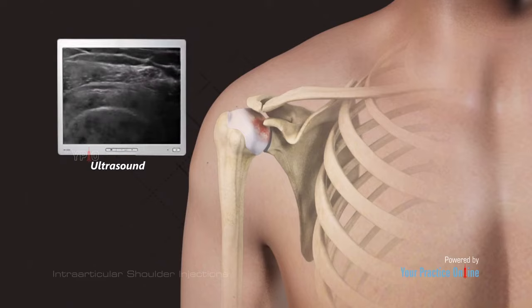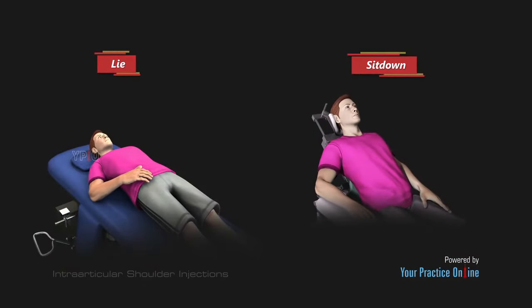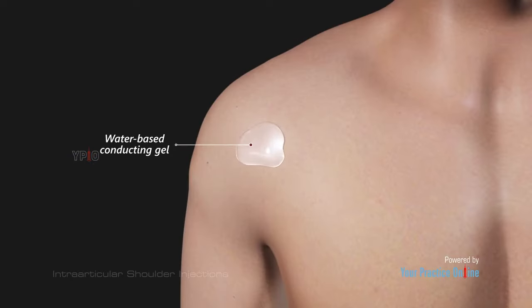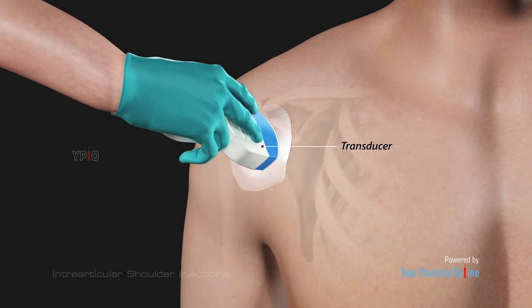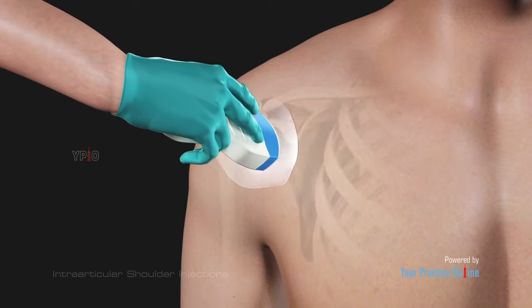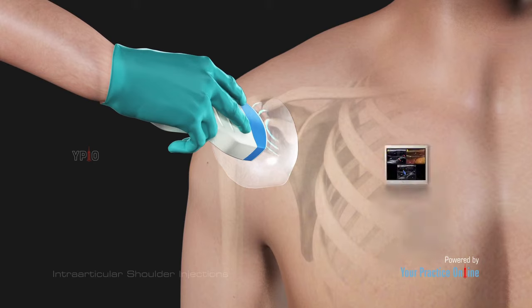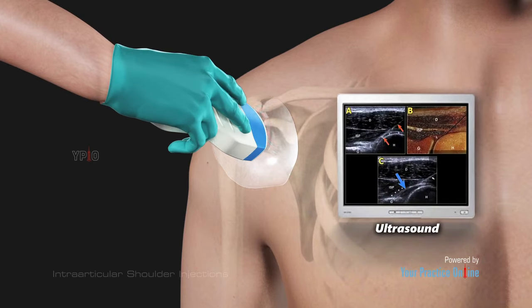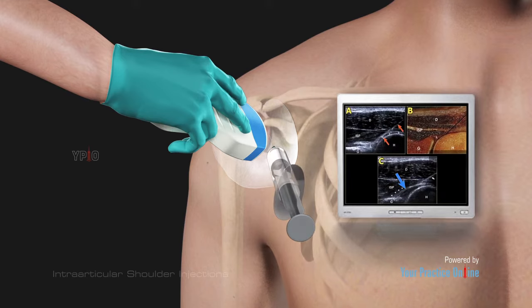During an ultrasound-guided intra-articular shoulder injection, you will be asked to lie or sit down depending on the site of the injection. A clear water-based conducting gel is applied over the skin to assist with transmission of the sound waves. Your doctor moves a hand-held probe called a transducer over the targeted area. The transducer emits sound waves and detects the rebound echoes from the tissue. Images are created from these sound waves and can be viewed on a display monitor, providing a clear view of the targeted area and helping your doctor guide the needle to the correct site for the injection.